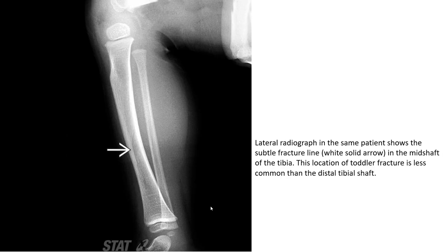The lateral radiograph in the same patient shows the subtle fracture line, indicated by the solid arrow, in the mid-shaft of the tibia. Mid-shaft location of the toddler fracture is less common than the distal tibia shaft.